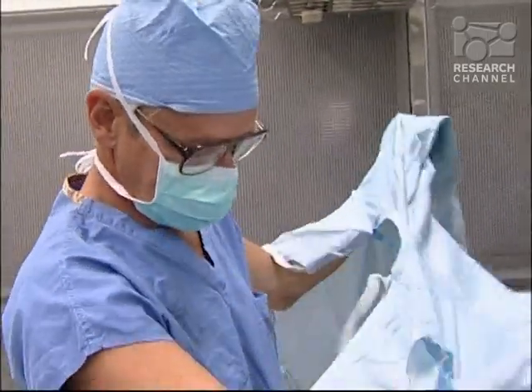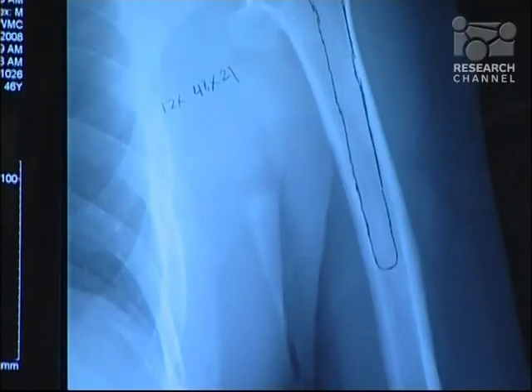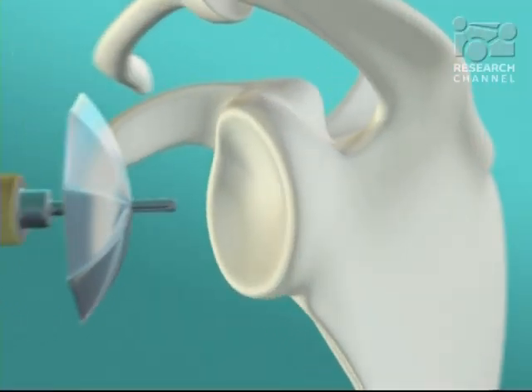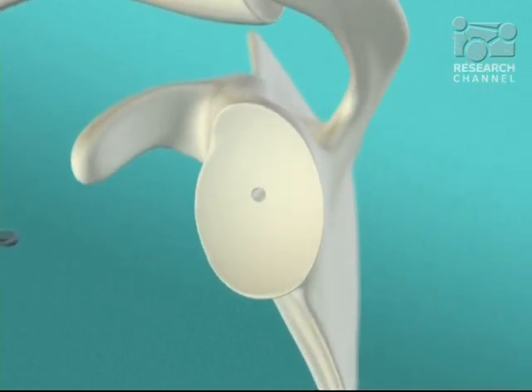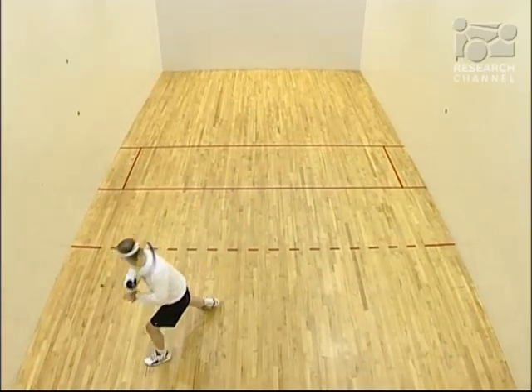Dr. Mattson pioneered a surgical procedure called Ream and Run, which places a metal ball on the arm bone side of the arthritic shoulder, but uses a biological approach to repair the socket side. As he explains: 'We actually grind the socket to exactly the right shape and smoothness and let the body heal that over again as the ball works on it during the rehabilitation period. We're using the reaming of the socket to form the perfect shape, but then let nature resurface it with a biological surface that doesn't wear and doesn't loosen, and that will remodel according to the way they use their arm.'